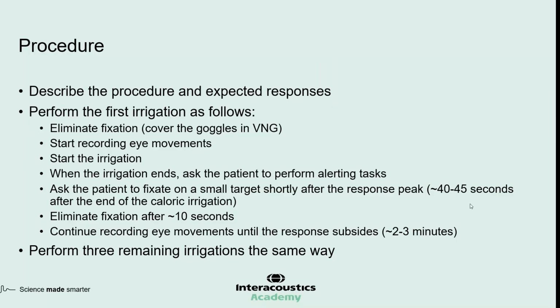So the procedure, most of you are familiar with it. First, you should describe the procedure to the patient, without scaring them, but accurately describing what will happen to them. Most patients are worried that they will be sick, so you need to reassure them that in most cases this will not happen. I'll talk about this a little bit later. There are procedures that you can follow in order to minimize the chance of patient discomfort.